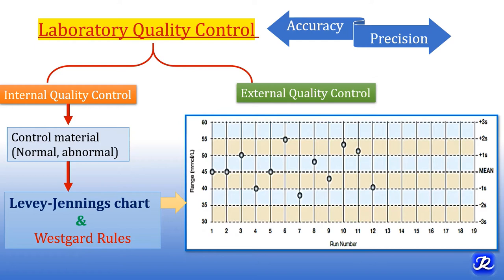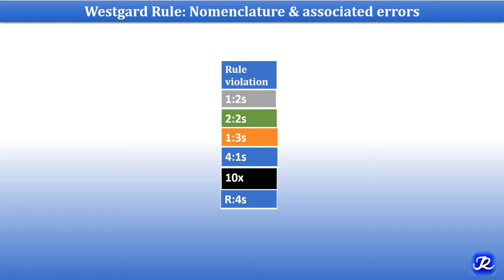A Levy-Jennings chart is a graphical method for displaying control results and evaluating whether a run is in control or out of control. Mean and standard deviations are required to construct this LJ chart, and daily values are plotted versus time. Westgard rules decide whether an analytical run is in control or out of control, and these rules can only be applied if quality control values are plotted within the range of mean ±3 standard deviations. There are various Westgard rules: 1-2S, 2-2S, 1-3S, 4-1S, 10X, and R4S.